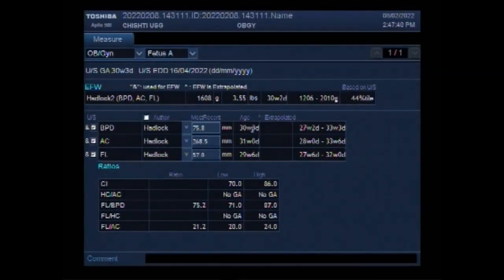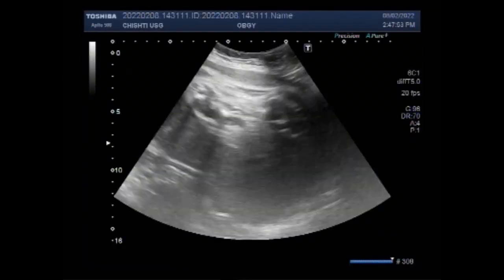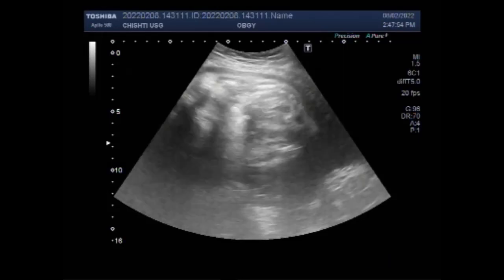Dear viewers, I hope you are all fine. This ultrasound video shows a rare case of nephrolithiasis in a fetus with cystic disease of kidney, urinary retention and oligohydramnios, and multiple fetal anomalies.